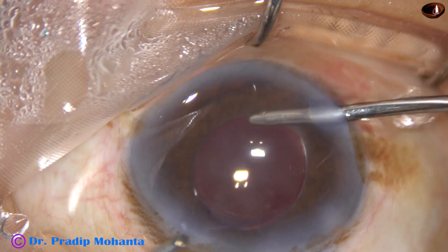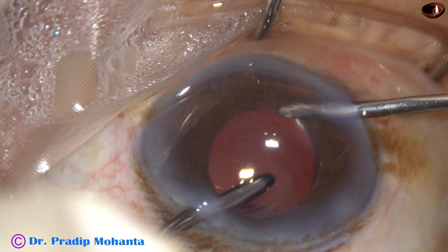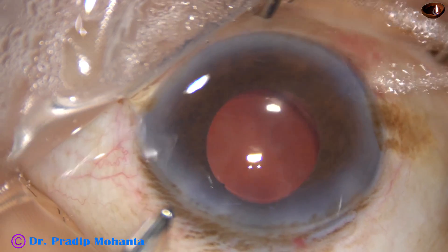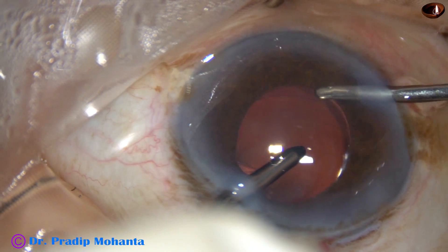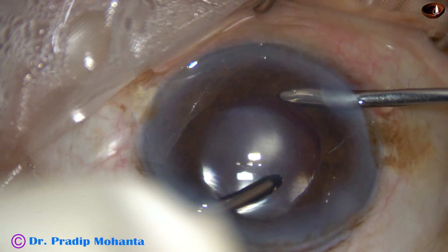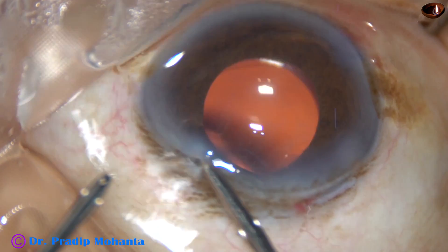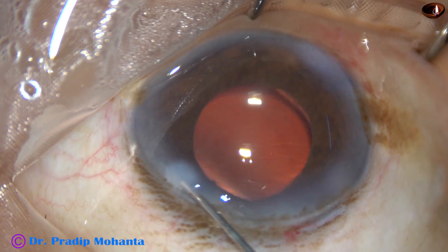Now I have to remove the visco thoroughly. Friends, patience — more patience — still more patience is the key to success in such challenging cases. I took 27 minutes for this surgery, which has been edited down to about 15 minutes, but still it is a lot of time. If you have watched this whole surgery, it has increased your patience, and I hope you will be encouraged to take challenging cases and develop the necessary skills to manage them.